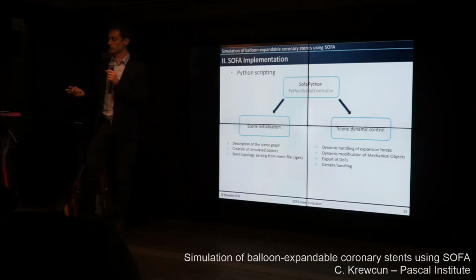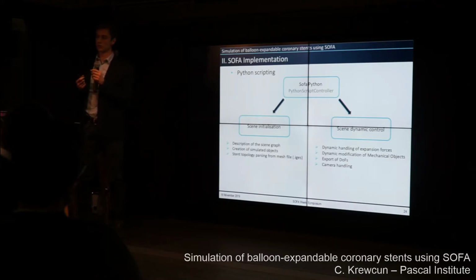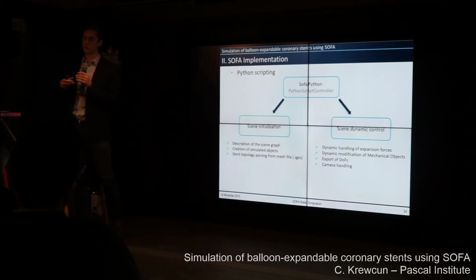And then we also use a lot of Python to dynamically control the simulation, mainly the way we model the expansion forces, which are in reality created by the balloon, and also to access the mechanical objects in the simulation. Regarding this, I'd just like to say that I'm very interested by the modification we talked about this morning regarding SOFA Python 3.